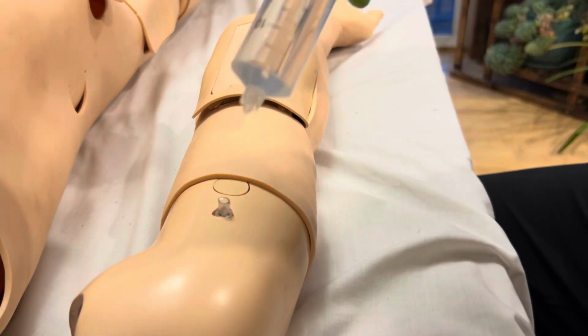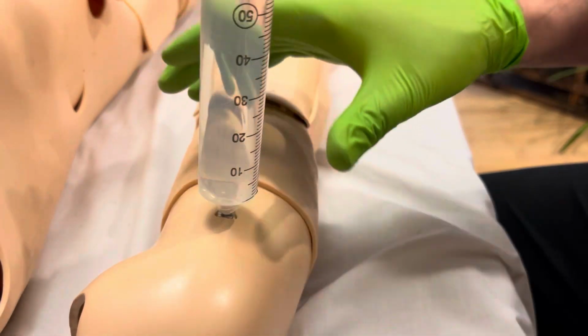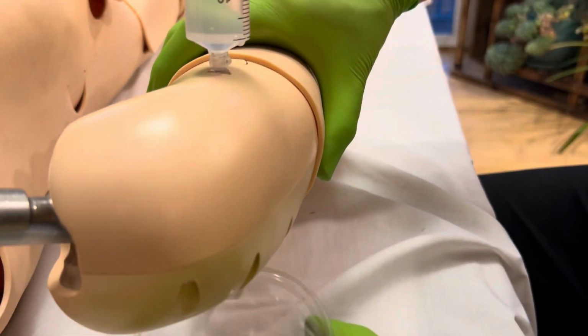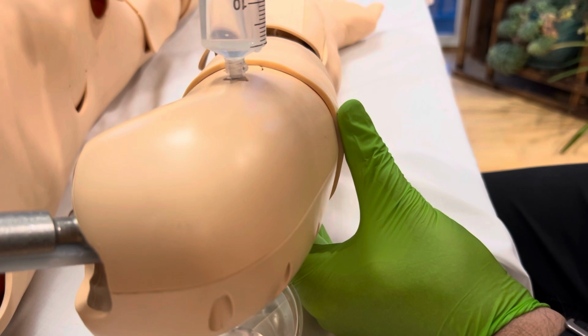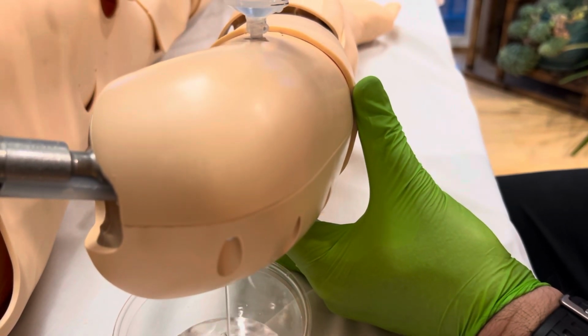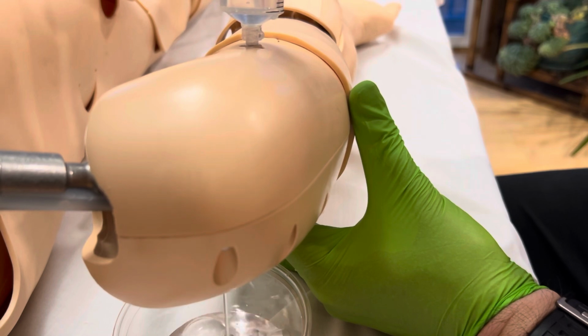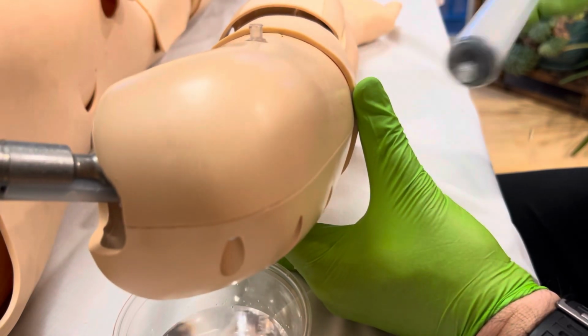All right, I have my syringe filled with distilled water. Just go ahead and screw it on there, and then I'm just going to use a cup to collect the fluid because I can't find my IV bag. So you can see it's pouring out the back quite nicely. And I like to do a syringe full of air after that.